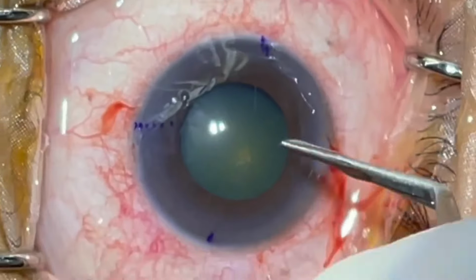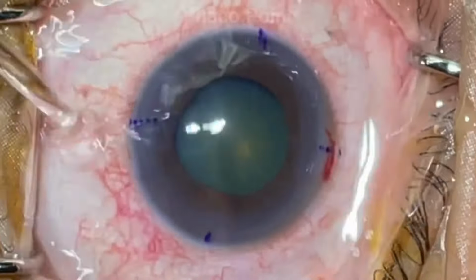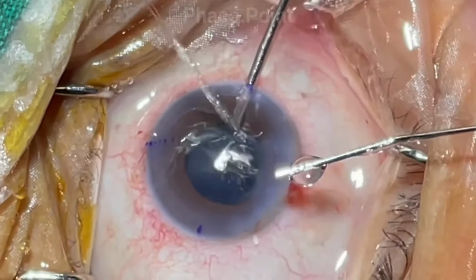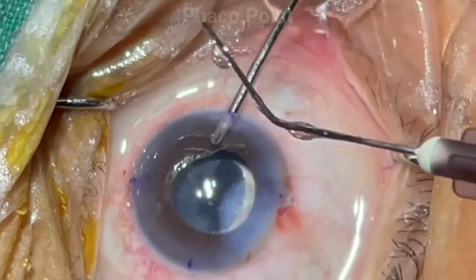It's just worth noting that the main incision here is what is going to be used for the phacoemulsification, and this opposing clear corneal incision is now going to be left undisturbed till the very end, wherein it's just going to be hydrated at the end of the surgery. Upon completion of the lens insertion as well as removal of the viscoelastic, the surgeon now, whilst maintaining the irrigation in the eye, moves to hydrating the incisions. As you can see, this is the main incision being hydrated.